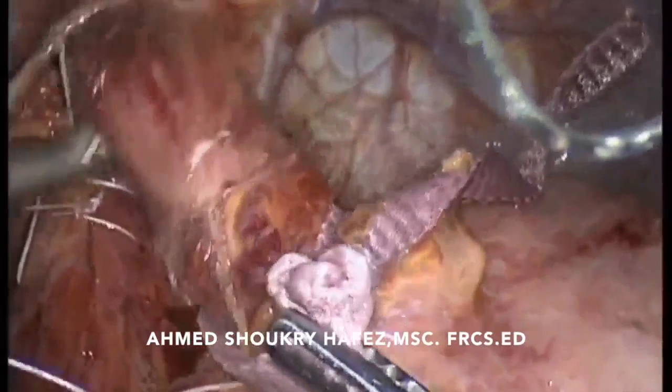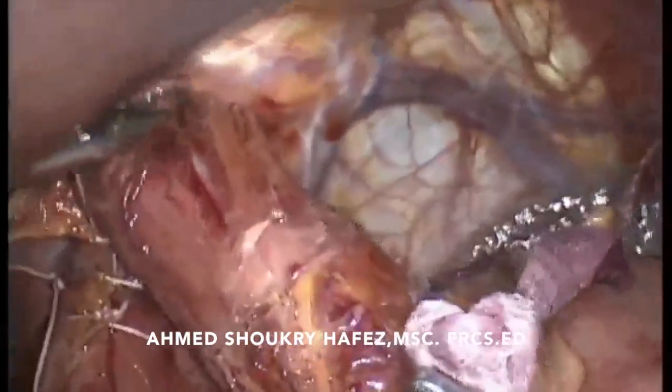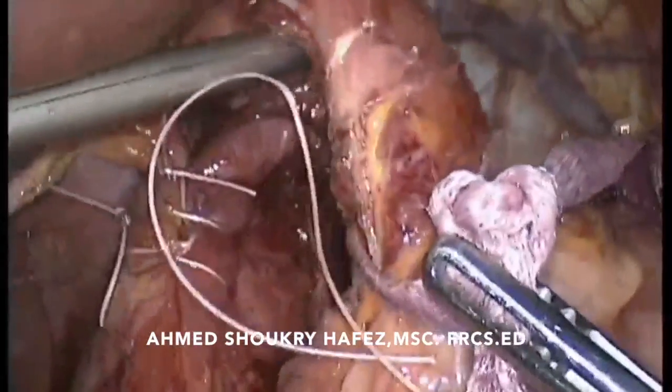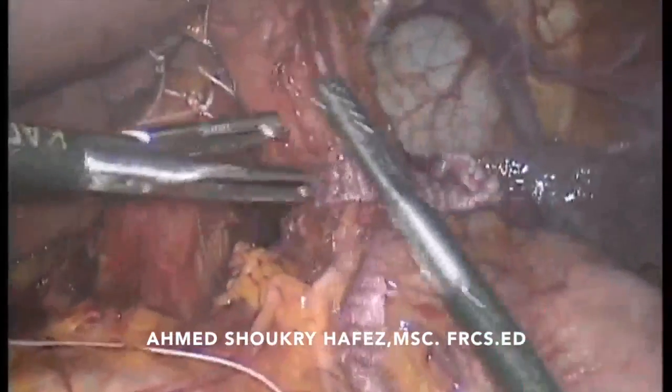But this patient has very weak peristalsis. We did not put any more crural stitches so as not to tighten the remaining hiatus around the weak esophagus.